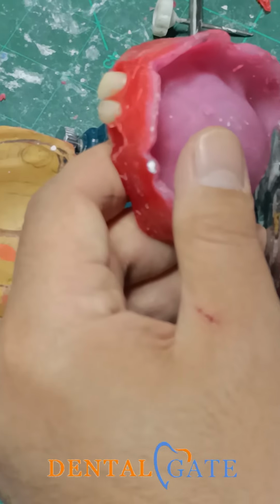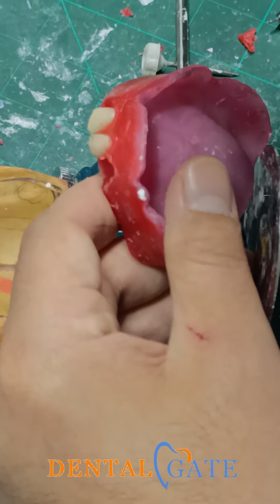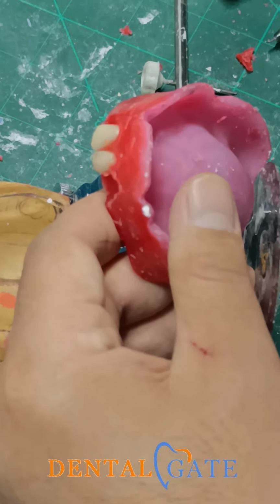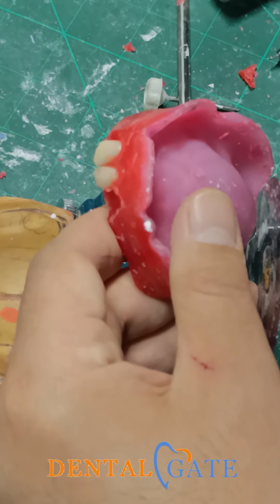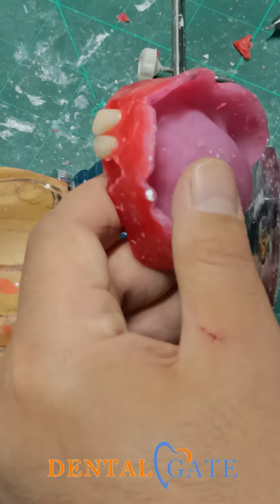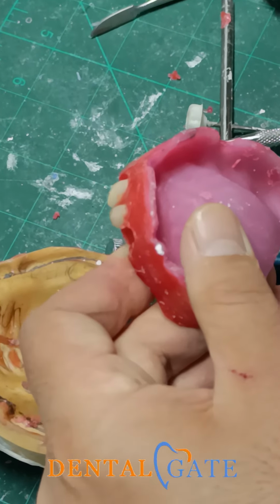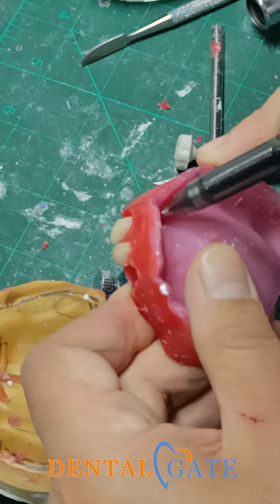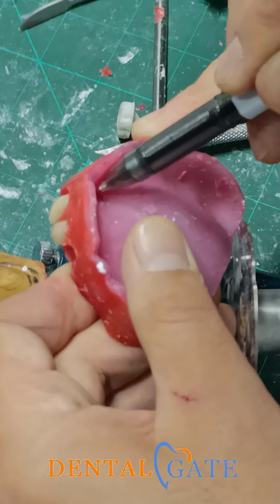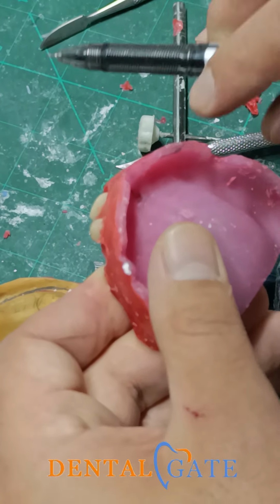Sometimes some technicians or some labs start with the molar. This is a good step, but you don't have the appropriate position for the central. Our recommendation in the literature is to start with the central incisor with this measurement and follow the arrangement of the posterior teeth. What I mean now, you can make a check. This is the central incisor. This is the incisive papilla. You can see it's about 6 to 8 millimeters. Okay, the distance between the central incisor and the papilla.